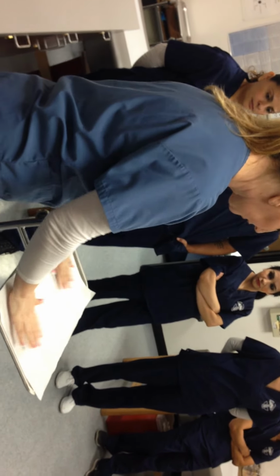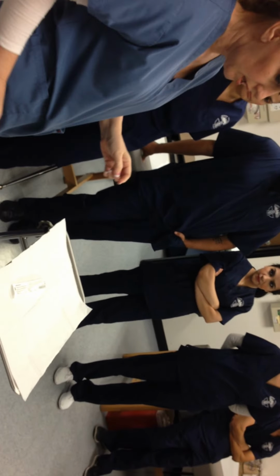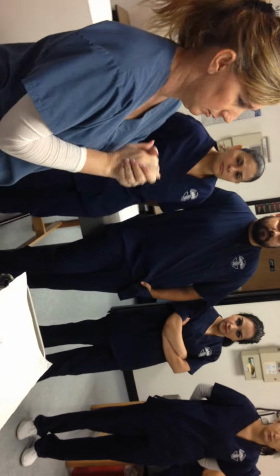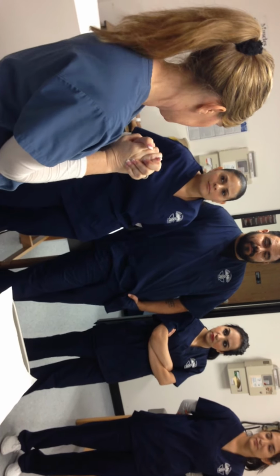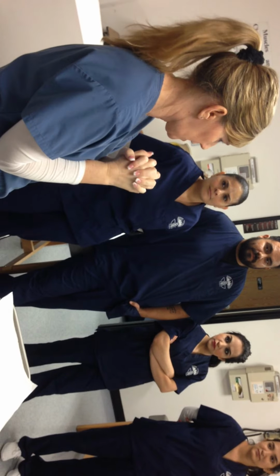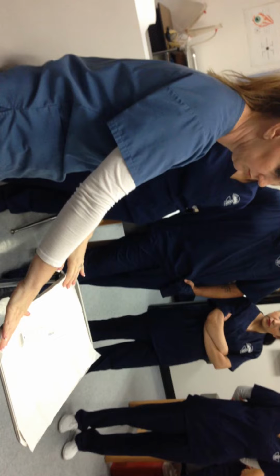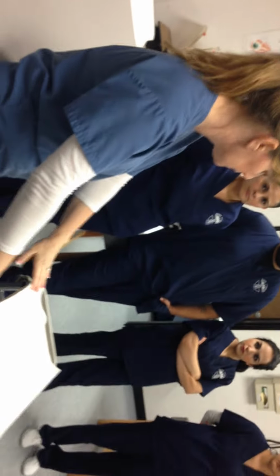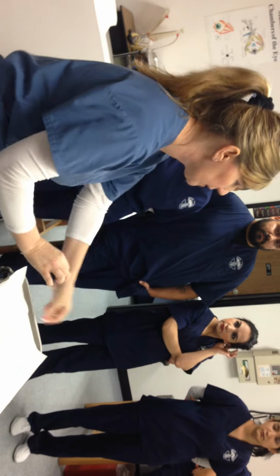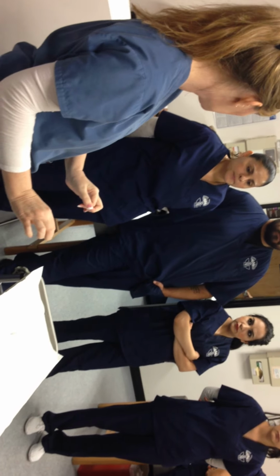Okay, so we're going to put that there. We're going to put our syringe here. And please, let me beg you all, please make a dirty area and a clean area on your tray. Oh my God, that's so OCD. No, it's not. What happens is, if you don't have a clean and a dirty area, you're going to start grabbing your dirty stuff and try to clean off your patient with dirty stuff. We don't want to do that.